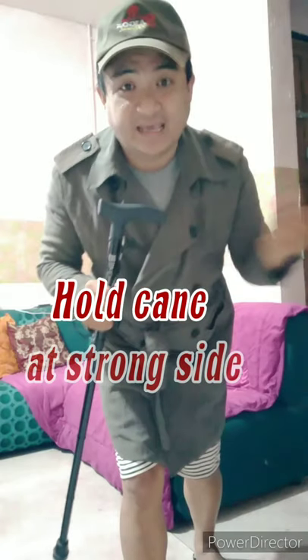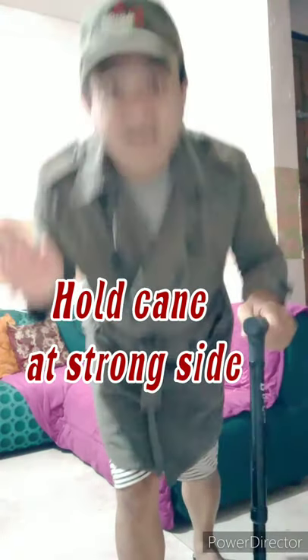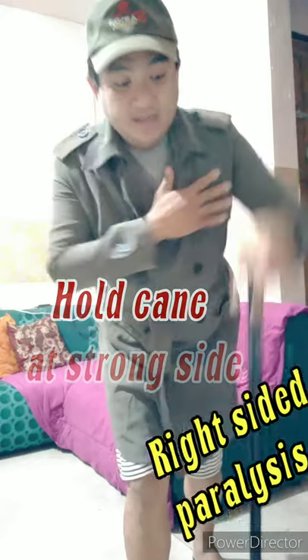Now let's talk about measurements. Please remember this: you have to let your patient hold the cane on the strong side — the strong side, not the weak side. So if your patient has right-sided paralysis, you let your patient hold the device on the left side.